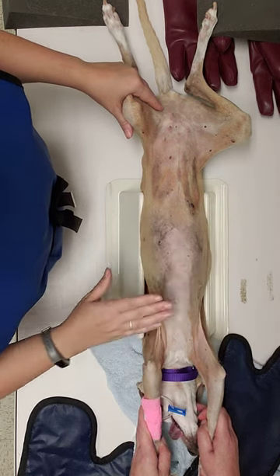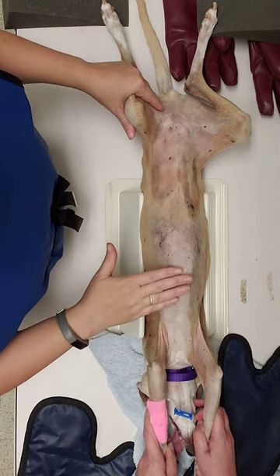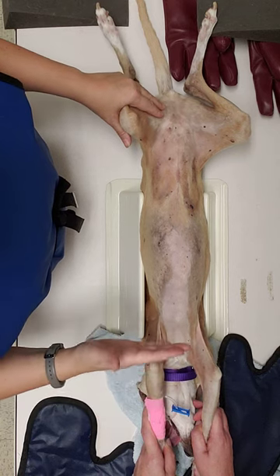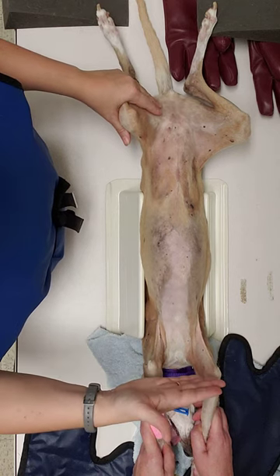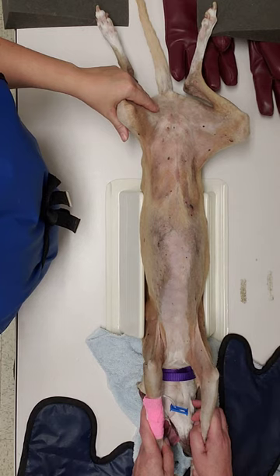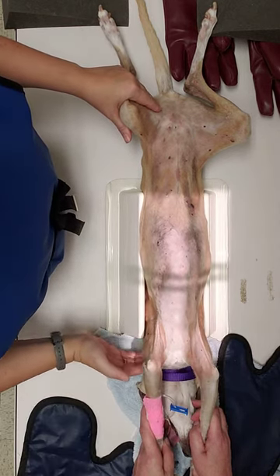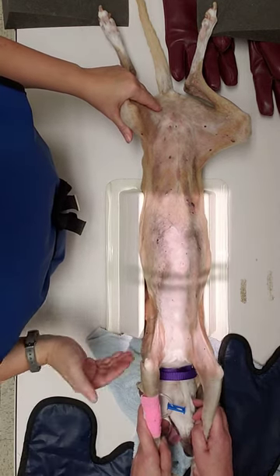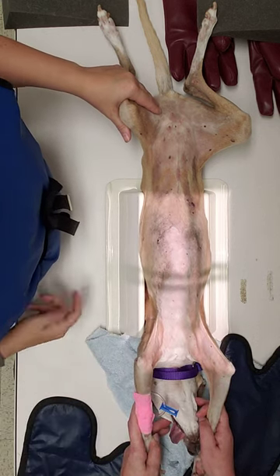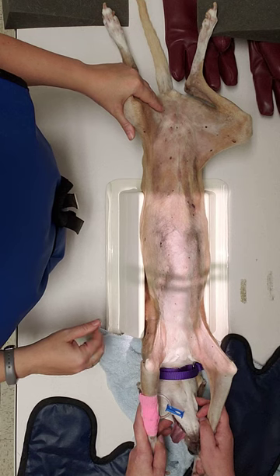In VD dorsal recumbency position, you're going to line up your light so that the cranial edge is equal to your thoracic inlet, your manubrium, or the shoulder joint. As you can see, it all falls about the same point. It depends on whether we're talking soft tissue or bone — what you can feel or see.